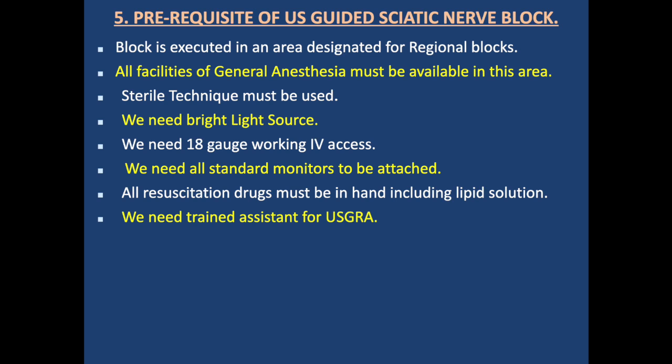Prerequisites of ultrasound guided gluteal crease sciatic nerve block. The block is executed in an area designated for regional block. All facilities for converting the patient to general anesthesia must be available. Sterile technique must be used. We need a bright light source.